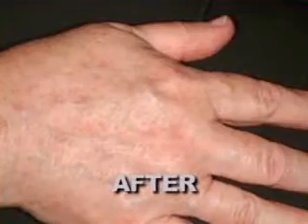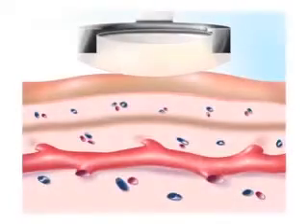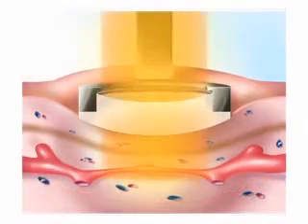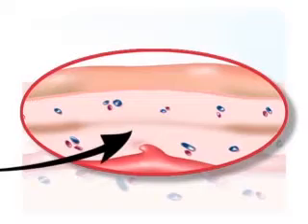And it's been great, because what we do with that is we apply it to the pigmented lesions, and with compression, we basically remove all the blood that's underneath it. So when we shine the light out of the laser on the pigmented spot, there's no blood that it addresses underneath, so you get no potential bruising. We can use higher energies, and it basically gets absorbed by the pigment.